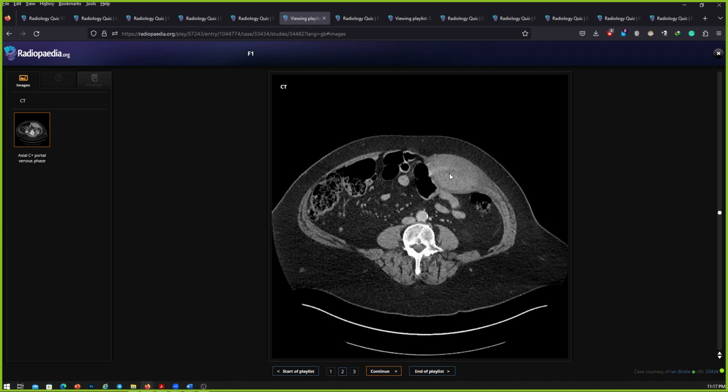Give me at least 3 histories. Trauma, and surgery, recent surgery. Okay. And also, if the patient is on medication, thrombolytic medication. Good, perfect. So you have to take the history of any direct or indirect trauma. That is the first one. Then any blood disorder, and the third being any history of anticoagulation therapy. So that is a medication, and maybe you can add the fourth one which you did. That is any recent surgery. So iatrogenic causes are also one of the causes in this particular case.